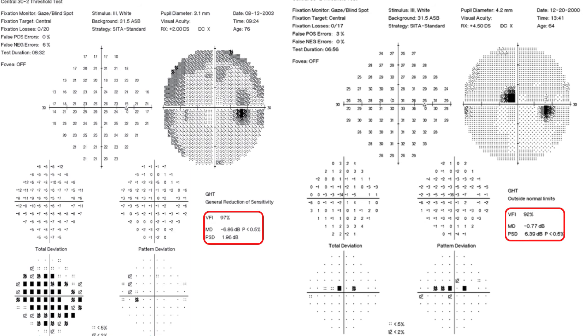On the left side, we have a general reduction of sensitivity with a mean deviation of minus 6 and VFI of 97%.